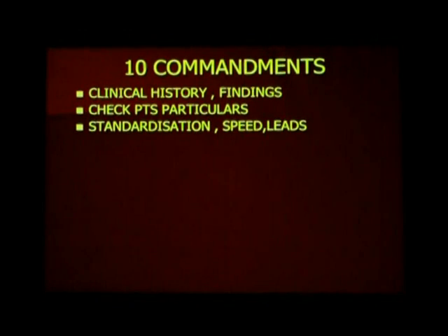Have you seen your ECG technician taking an ECG? How does he place it? Never like that, isn't it? Never between V2 and V4, right? So that's why the ECG recording is more important.